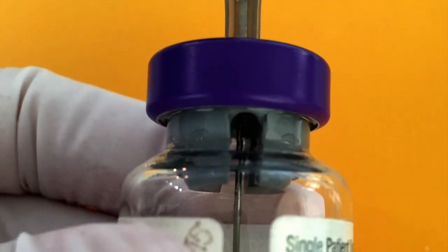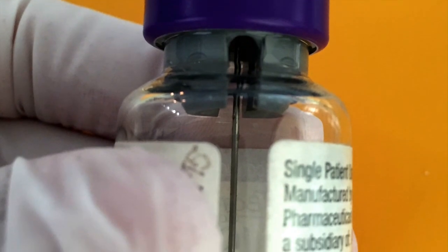One and a half inch or 4 cm long needles are good because they reach the bottom of the vial, avoiding waste.